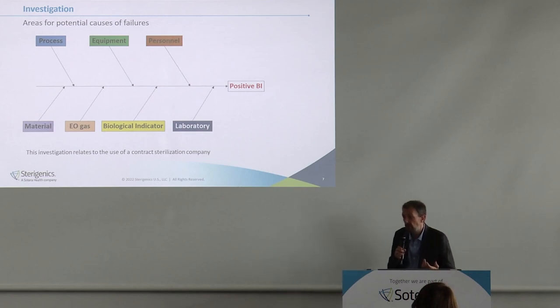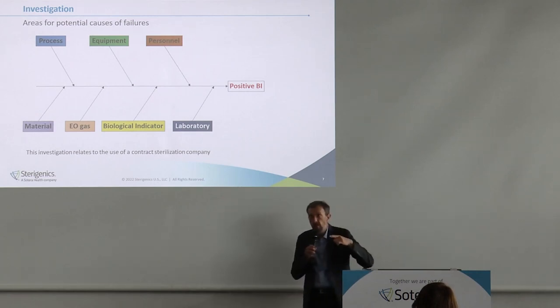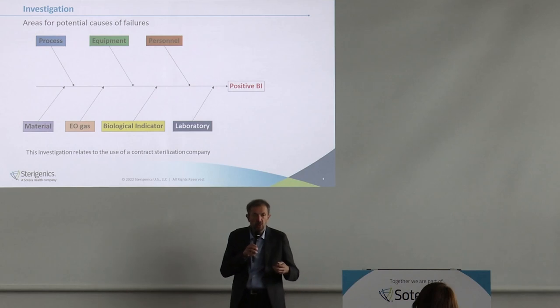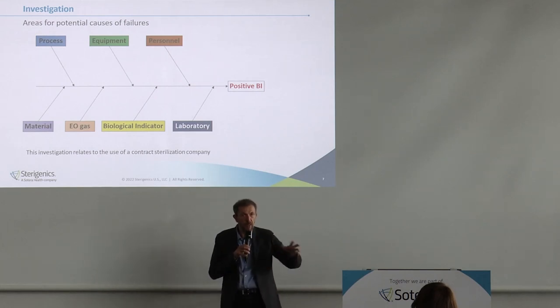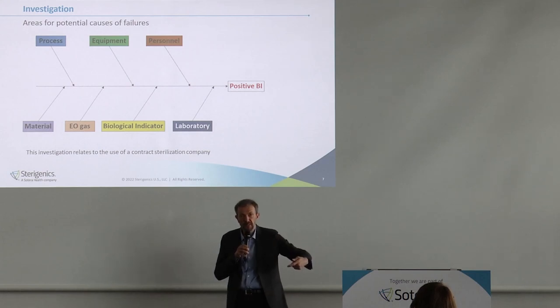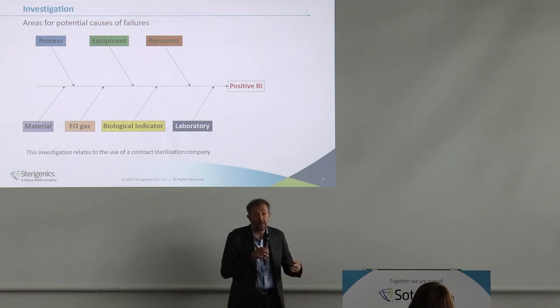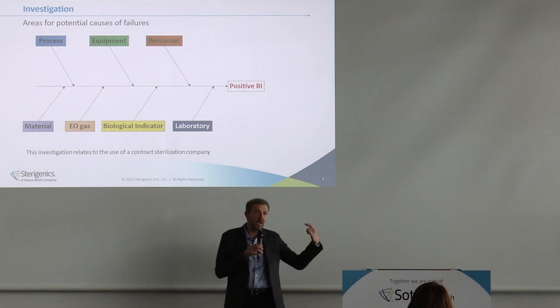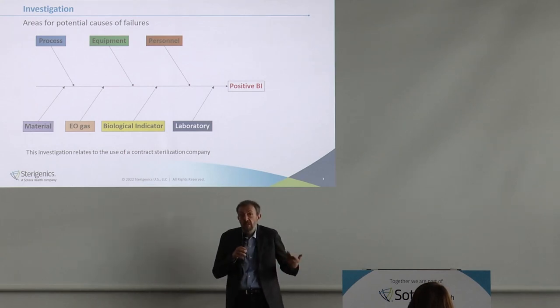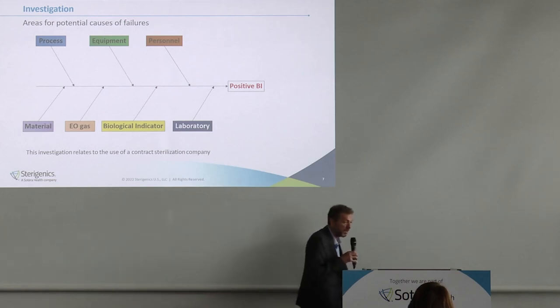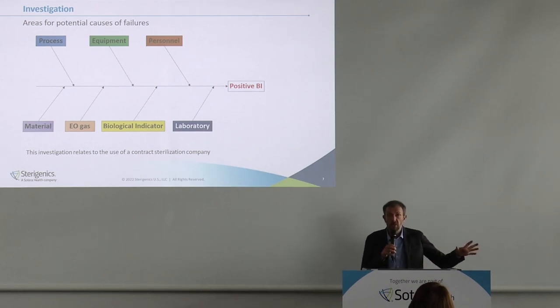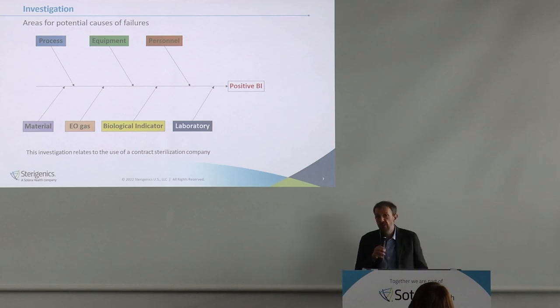One good example of contamination: when we incubate a validation load on which we expect growth, we will have some Bacillus atrophaeus around. If we then use the same laminar hood for the next testing, there might be a leftover from the previous testing that could be the root cause for the failure. In this case it's very hard to invalidate because it's going to be the same strain. It might be true it came from the prior validation, but it still has to be considered a true positive. To prevent this, we isolate and quarantine the laminar hood used for validation testing and do not use it for routine.